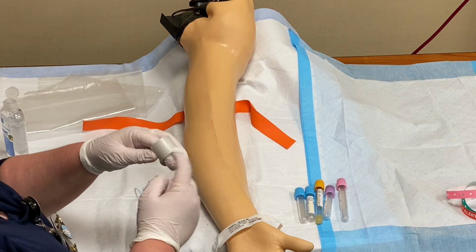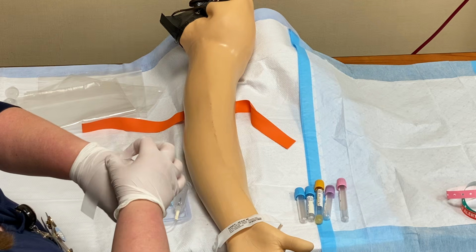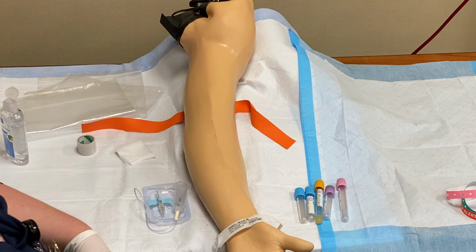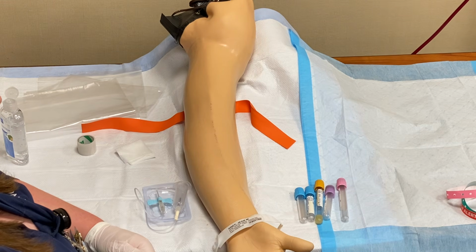So while that's drying, I'm gonna get a piece of tape. I'm gonna put it on the back of my glove because this is the cleanest area. I also wanna make sure I'm talking to my patient. Miss Gray, we're just letting your arm dry. We're almost ready to get started.